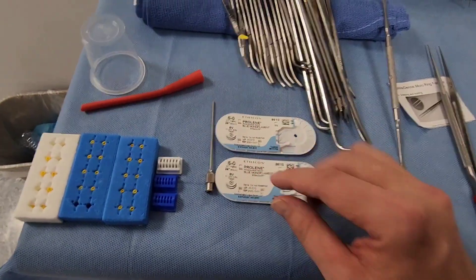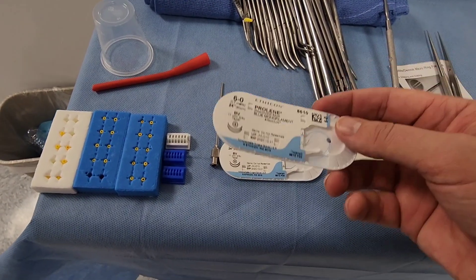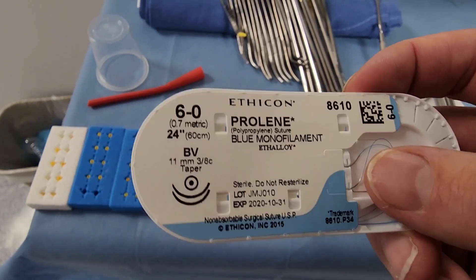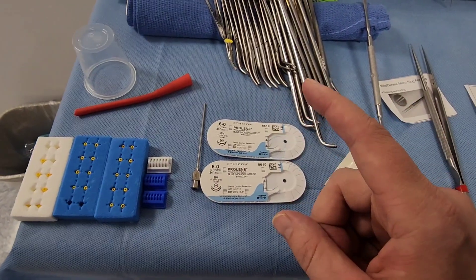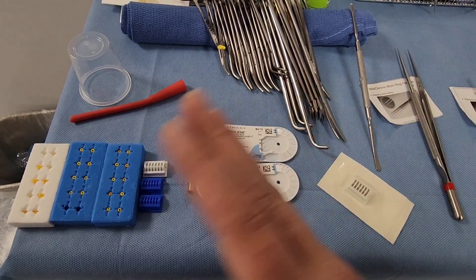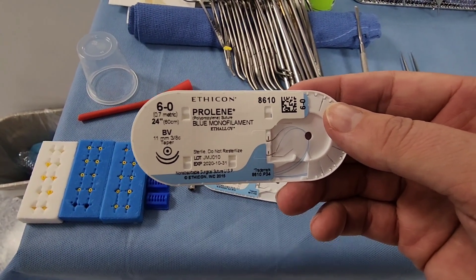Moving on to sutures: the most common type used in vascular is Prolene — 6-0 and 7-0 Prolene. These are double-armed, meaning there are two needles. When you anastomose something or put a patch together, you start on one side, make your way to the middle, then suture from the other side to the middle. Prolene is typically the most common suture in vascular cases.